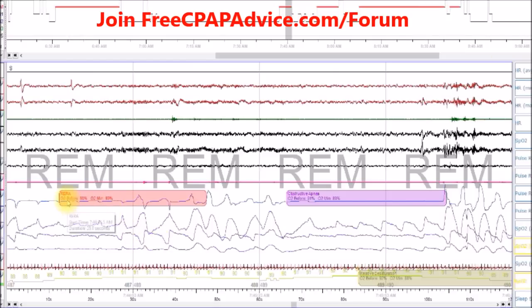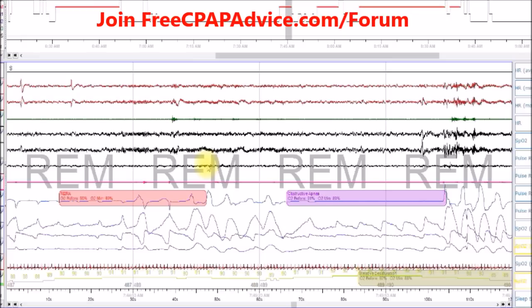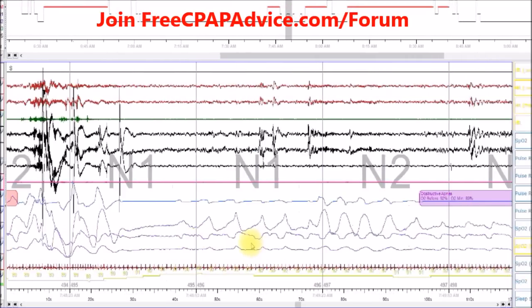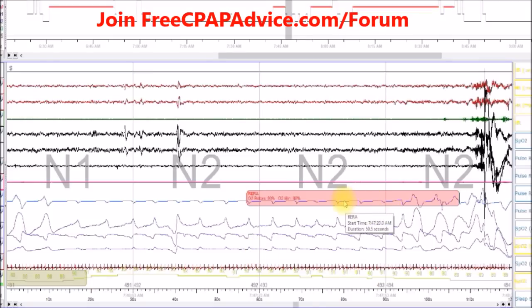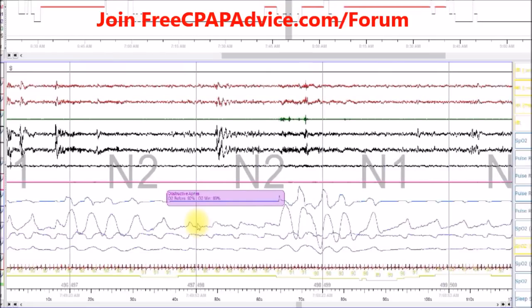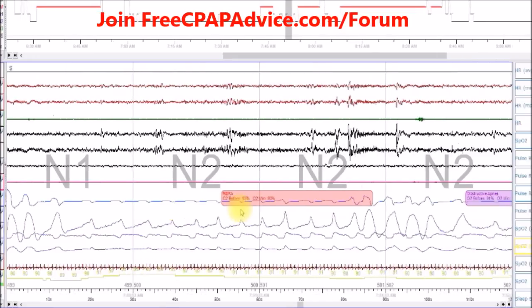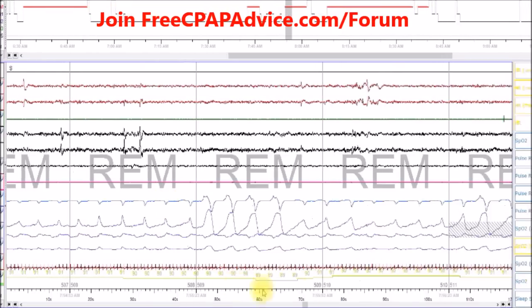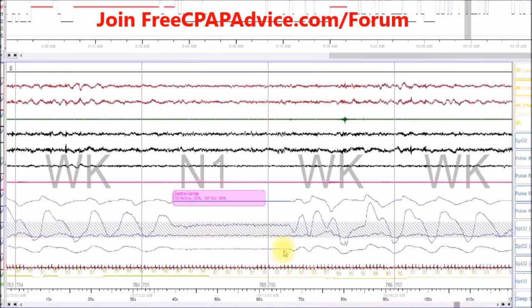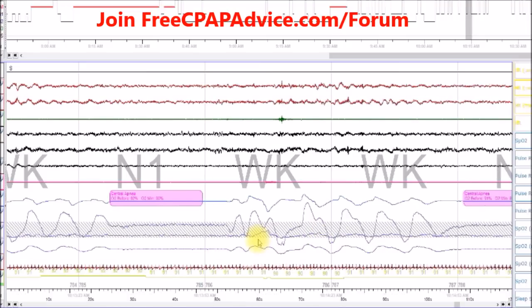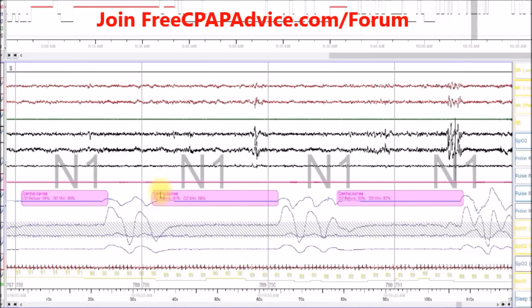Here's another example. We have a respiratory effort related arousal causing an oxygen desaturation and then an arousal. And then we have an obstructive apnea — a clear one that's very long — causing another arousal and a huge desaturation. This happens to be while in REM sleep. And here we have non-REM stage two, and we have another RERA, and then we have another obstructive sleep apnea. So these are obstructive type events. What makes this complex is that you have obstructive type events — which would be all of your mixed apneas, hypopneas, RERAs, and obstructive sleep apneas — mixed in with these central apneas that manifest at other parts during the night.